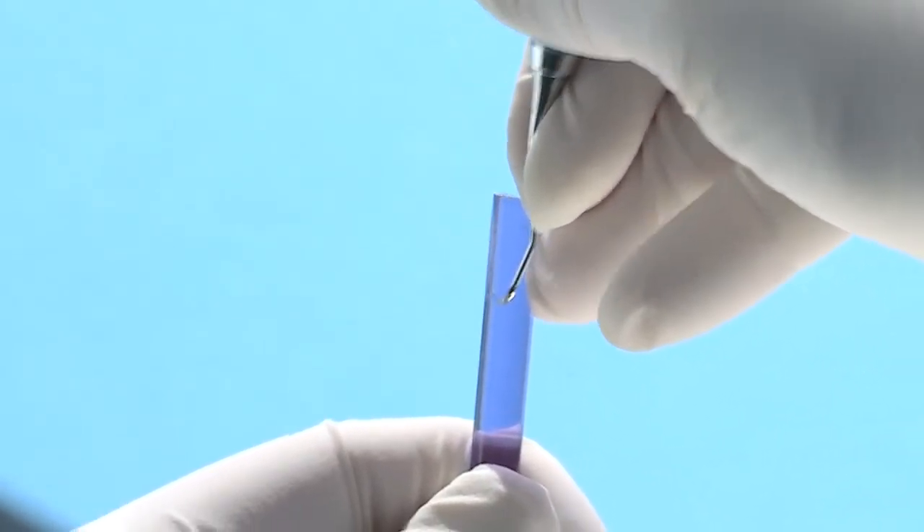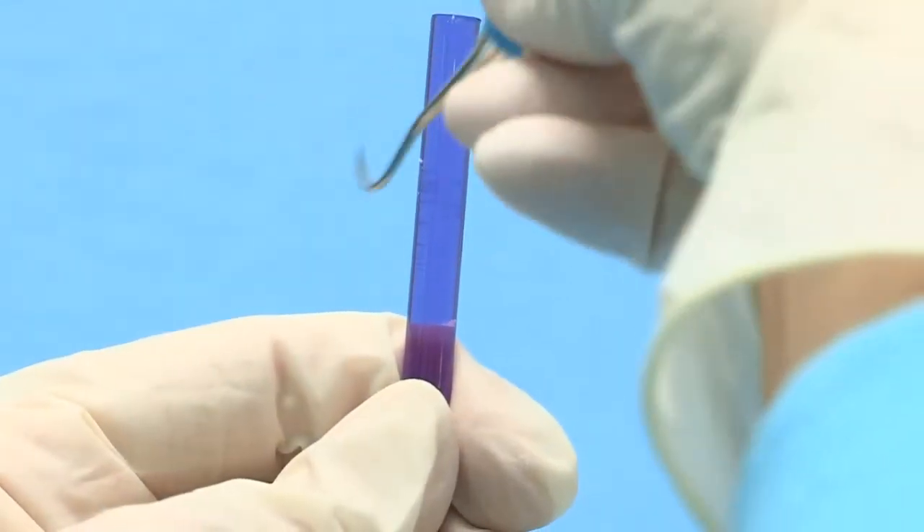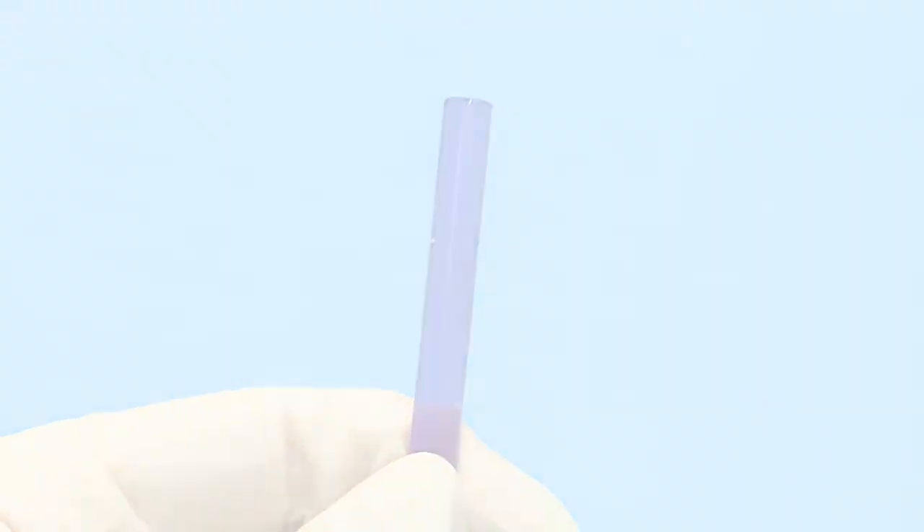It is important to note that the entire blade may not wear evenly. Some sections of the blade may be duller than other sections. For this reason, it is essential to assess the condition of the entire length of the blade.